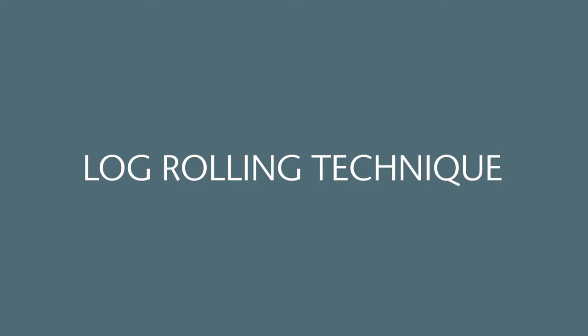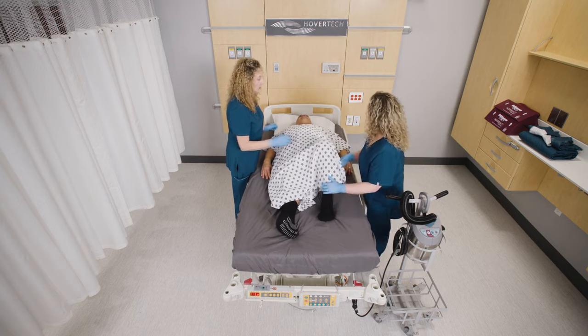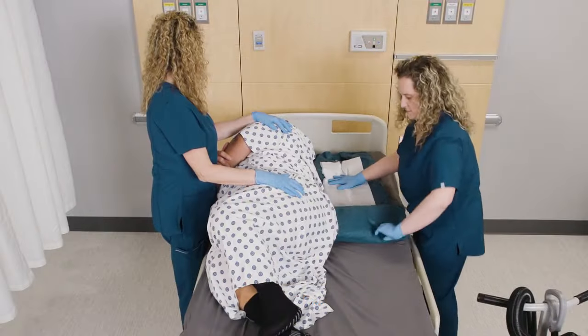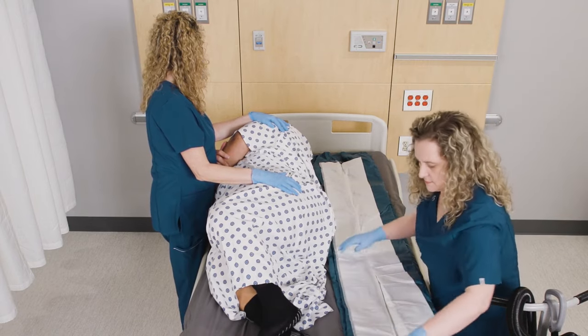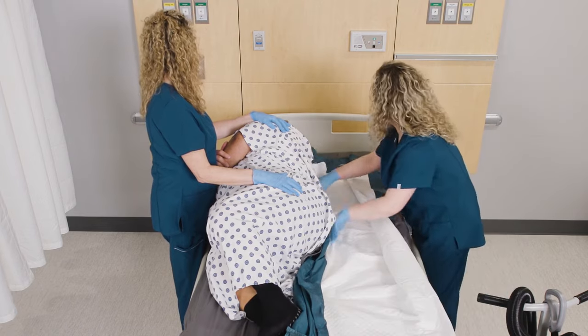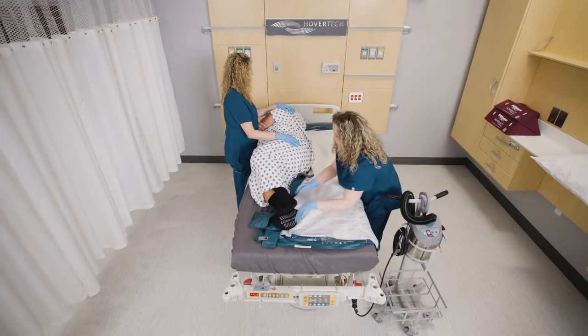Placing product under the patient — log rolling technique. Ensure the patient and bed are in a supine position. Bend the patient's knee and roll them onto their side. Open the product and place it lengthwise next to the patient. Unfold the Pro's AIR furthest from the patient to the side of the bed. Tuck the other side under the patient as far as possible.